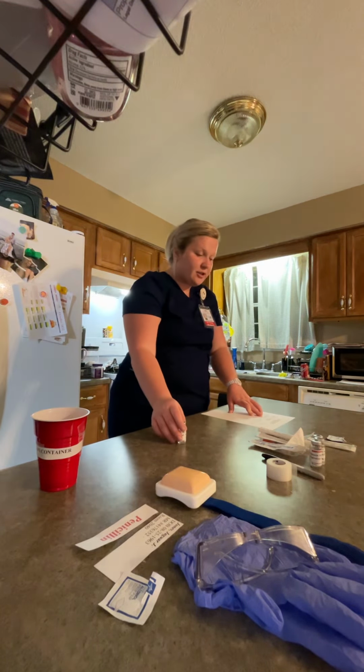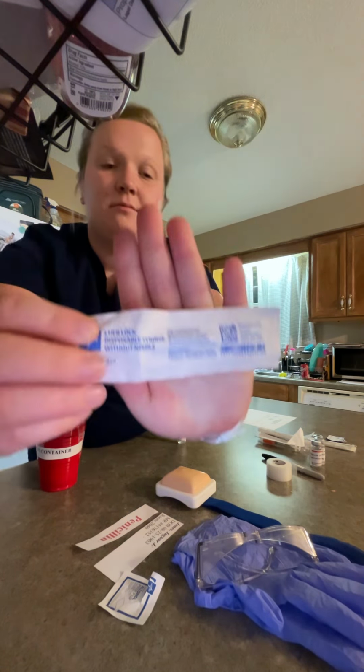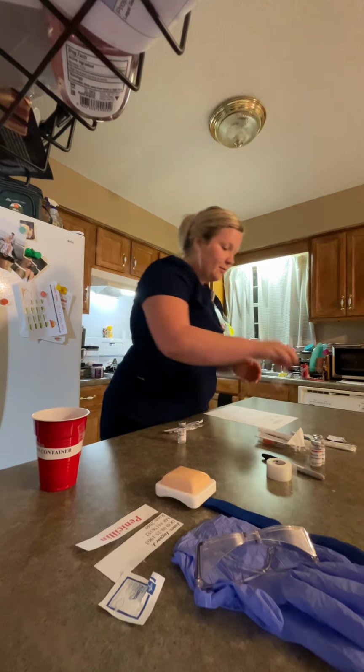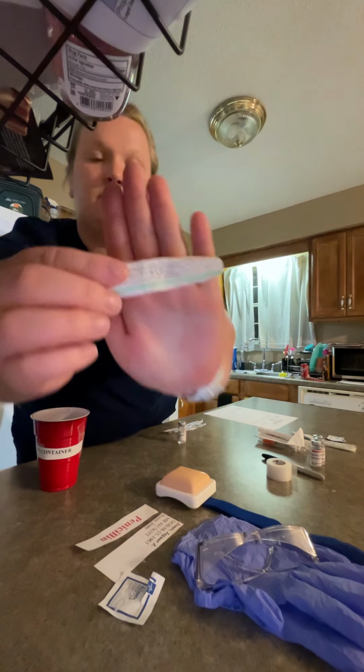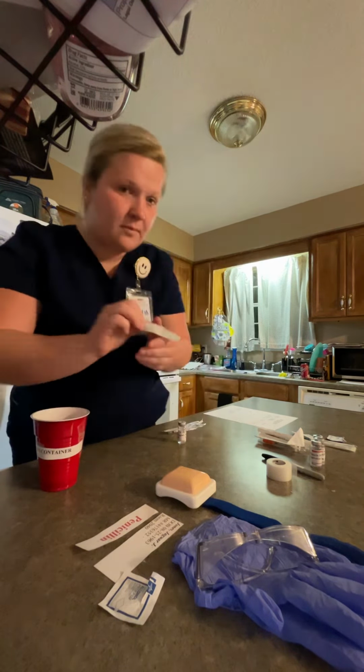This is an intramuscular injection, so I need a 3 milliliter syringe, a blunt tip cannula, and a 23 gauge needle. I'm going to put all the other vials and supplies to the side since I will not be needing those.